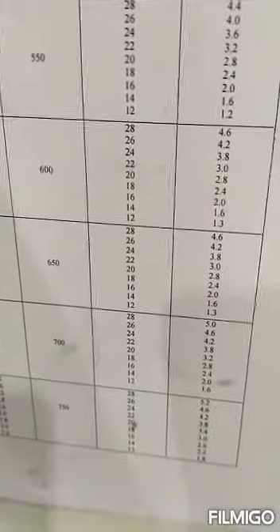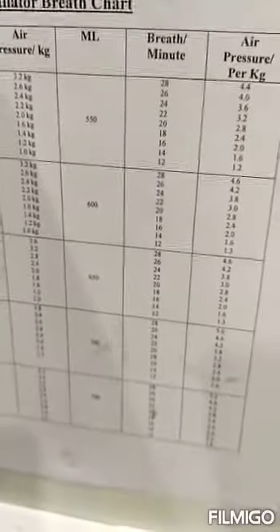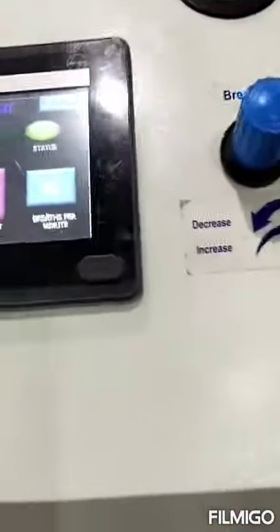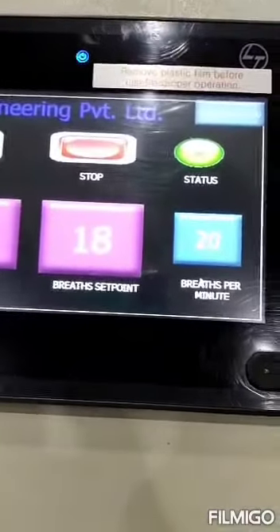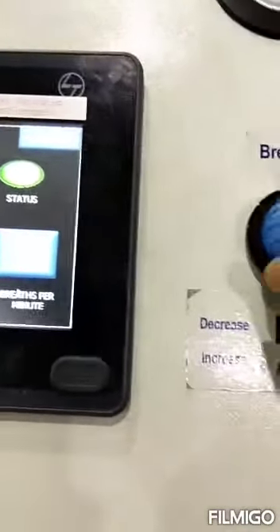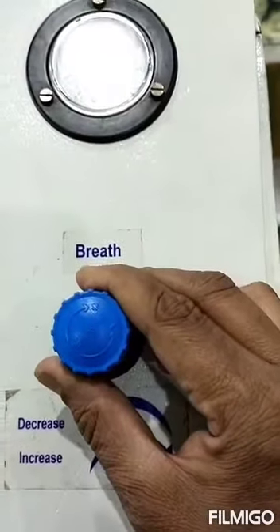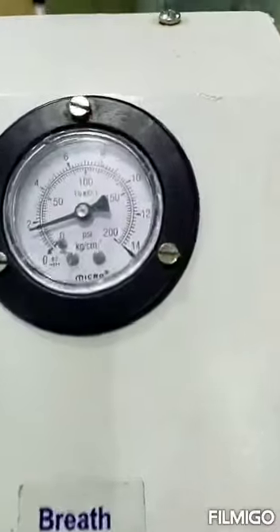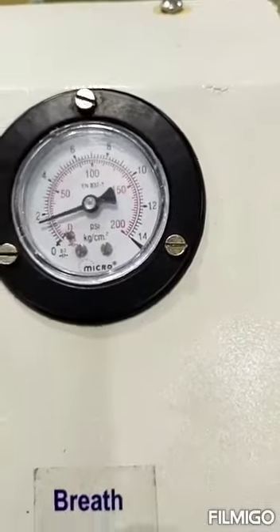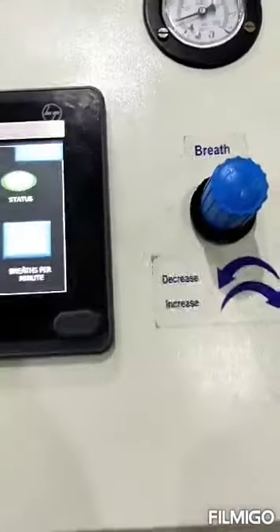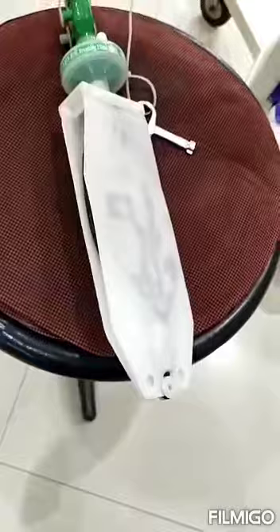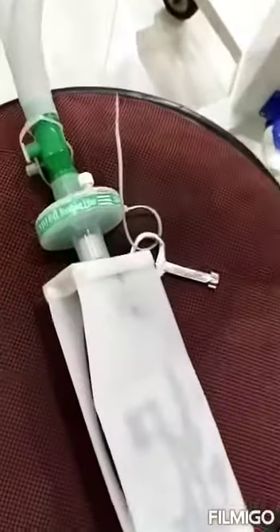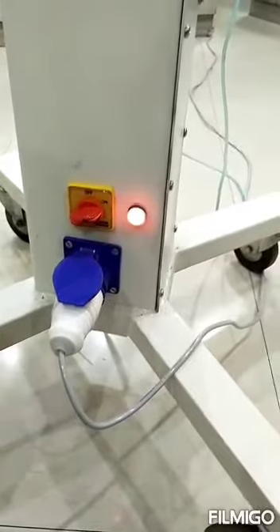We have to set the air pressure as per the requirement, as shown on the chart. Here we can set the air pressure. While inhaling and exhaling, the filter is also visible here. We have given power backup for half an hour as a second option.